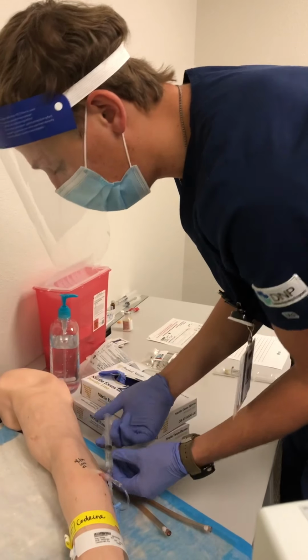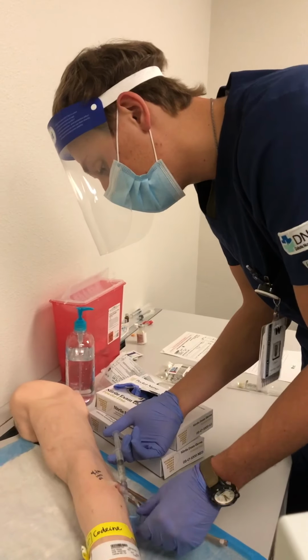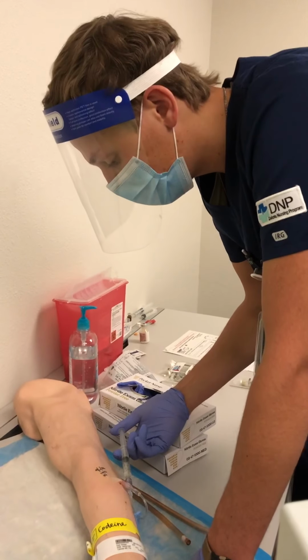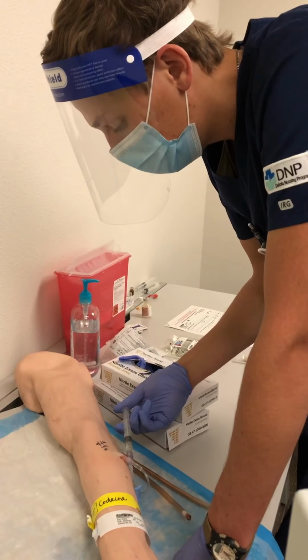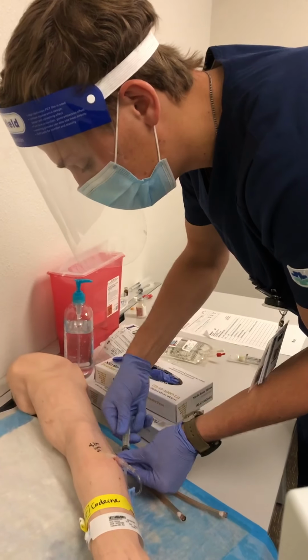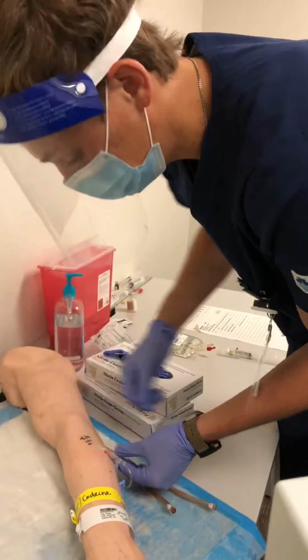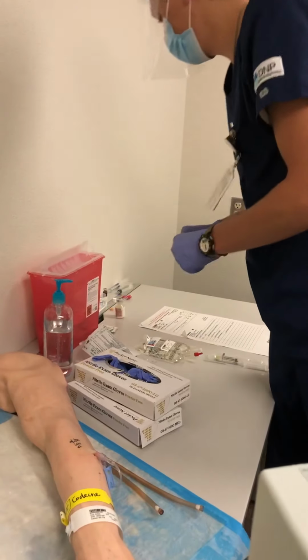And I'm going to push this last one a little bit slower because there may be some morphine left in the saline lock. So I just need to make sure to push this one a little slow at the beginning, maybe over a minute, and then I can go ahead and finish the rest of it. Okay, and so once those 3 are instilled, I can lock this back until I'm ready to connect the tubing.